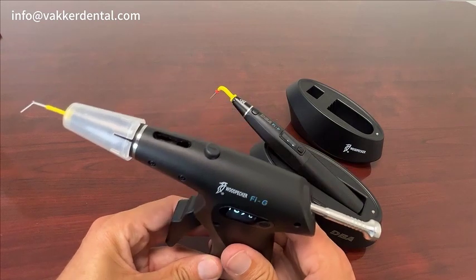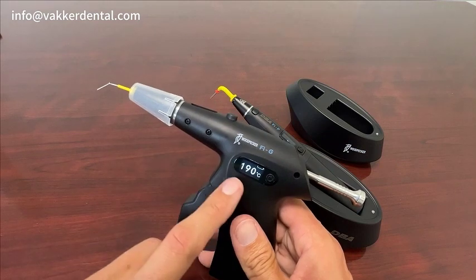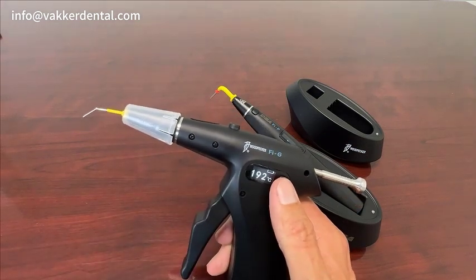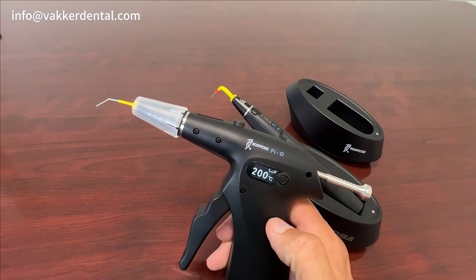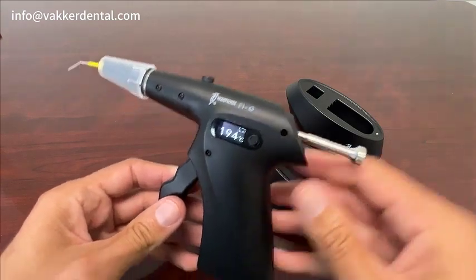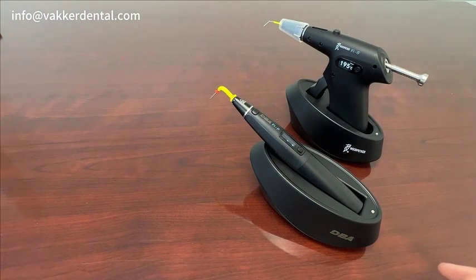If you have any questions — also, with the gutta-percha, it does have a temperature recommendation setting, which is when you'll want to adjust those settings. Put your gutta-percha in and off you go. Feel free to give us a call and we'll go from there. Thank you.